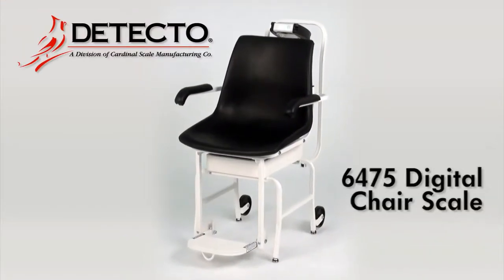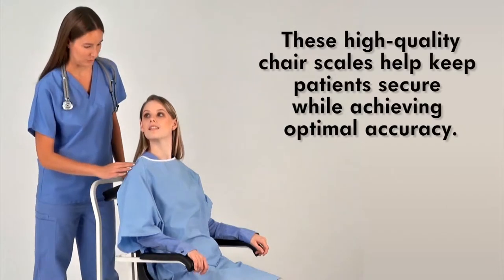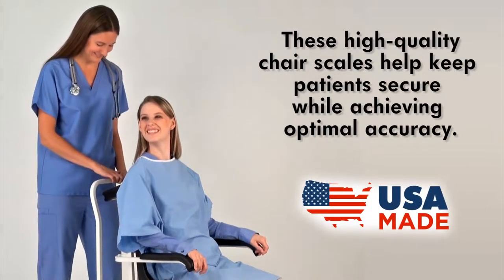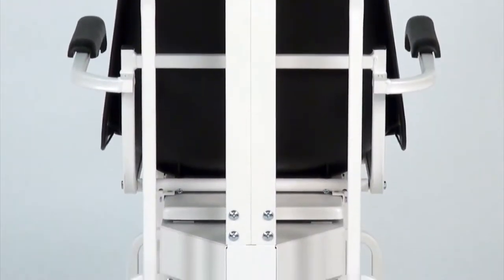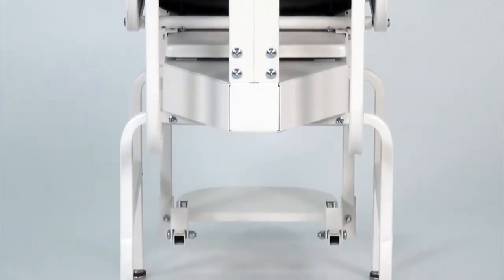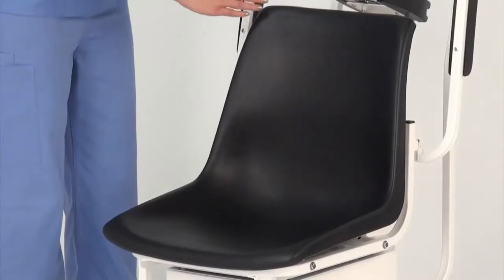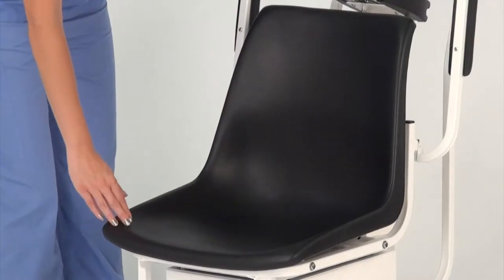Detecto's USA Made Model 6475 Digital Chair Scale arrives fully assembled and ready for weighing use. These high-quality chair scales help keep patients secure while achieving optimal accuracy. American-made quality steel construction is apparent throughout the scale, especially in the heavy-duty understructure which is designed for optimal strength and patient safety. The 6475 features a plastic-molded seat for the utmost in patient comfort.